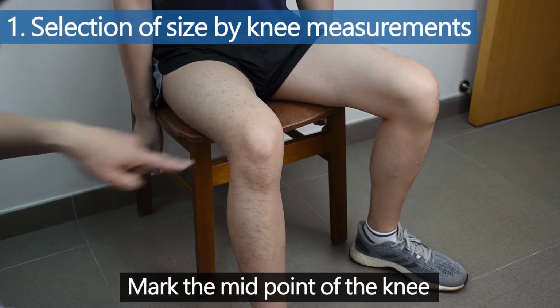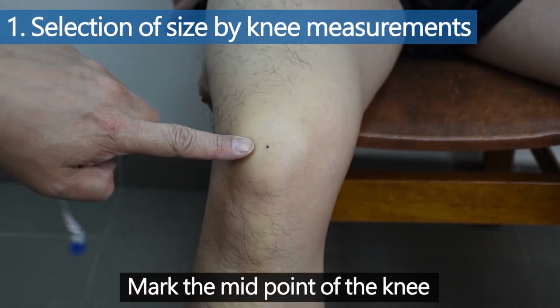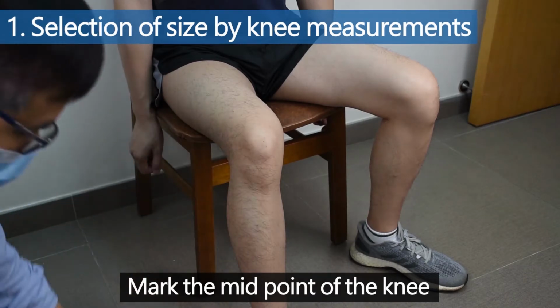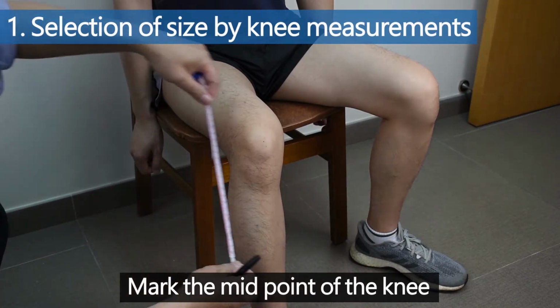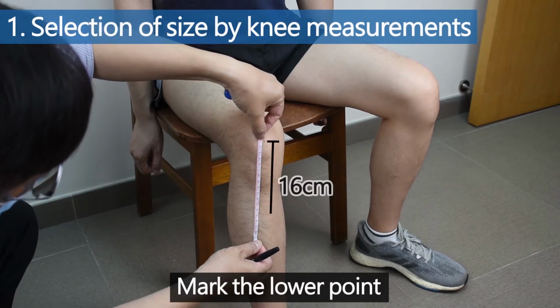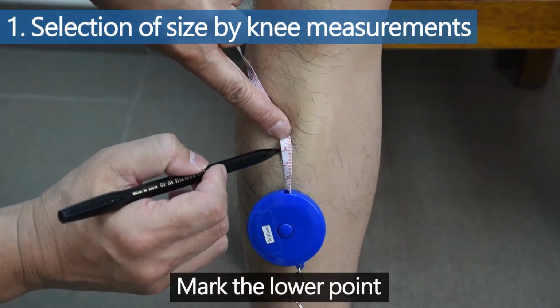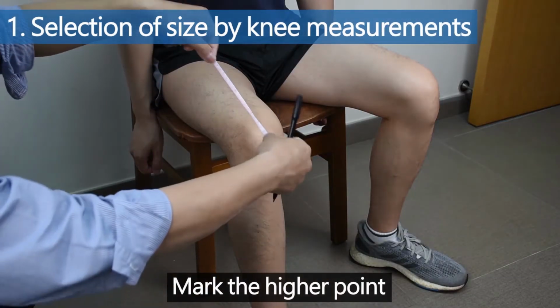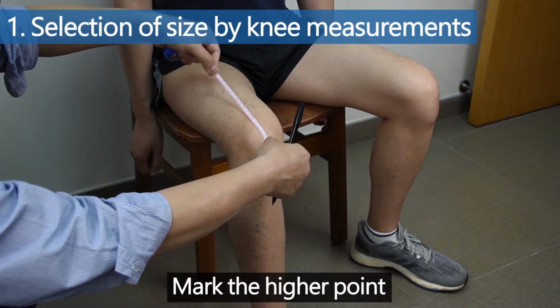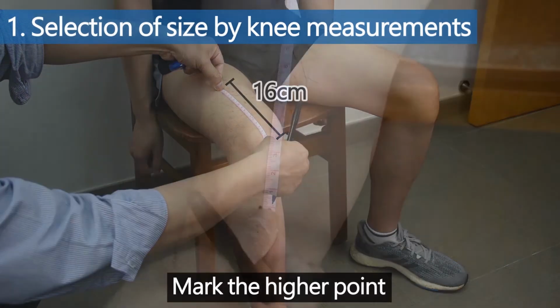1. Selection of size by knee measurements. First, mark the midpoint of the knee. Mark the lower point, which is 16 cm below the knee. Mark the higher point, which is 16 cm above the knee.